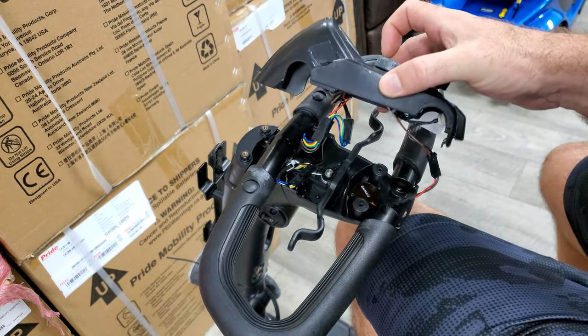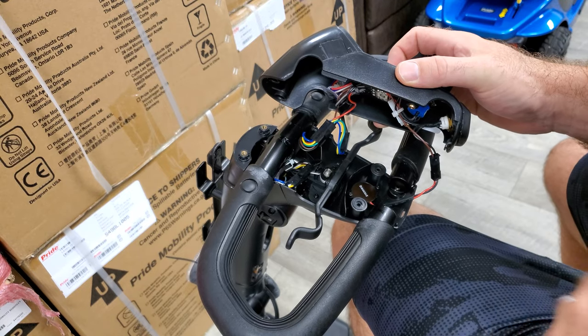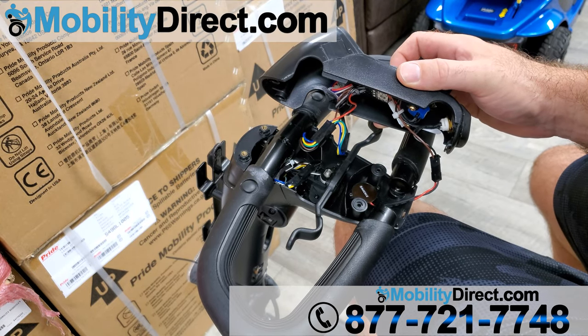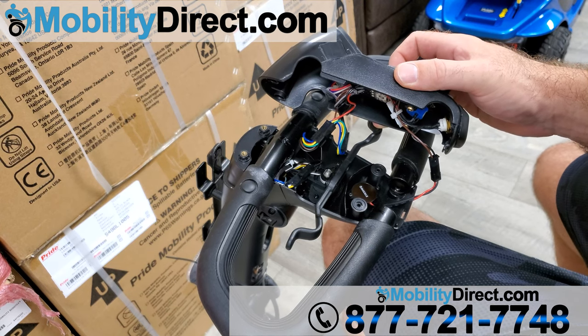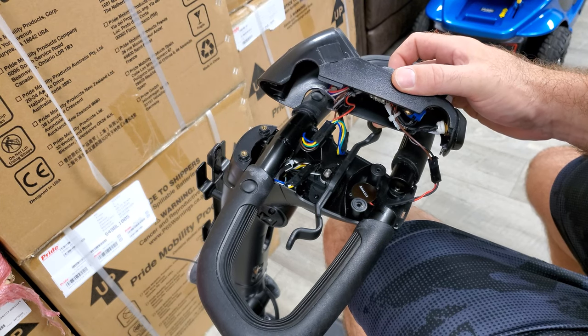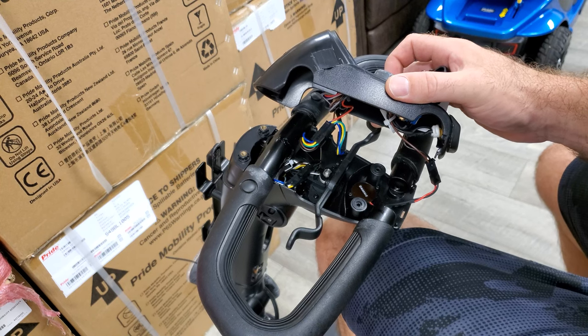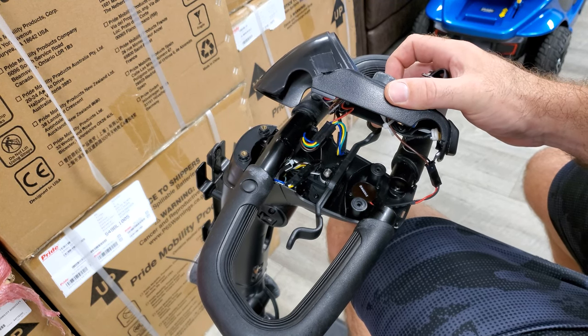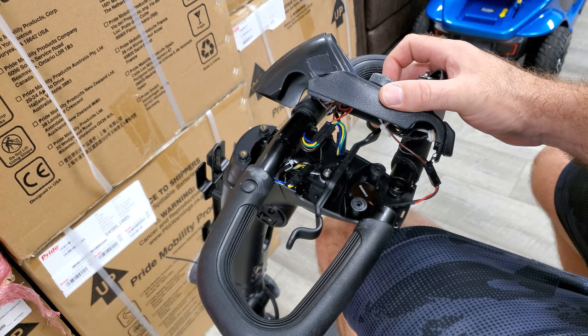Now keep in mind, all mobility scooters are different, so the location of the buzzer will be in various locations. It could be under the scooter, or it could be under the backside shroud of your scooter. You might want to look in your user manual to determine where the buzzer is on your scooter so that you can replace or disconnect it.